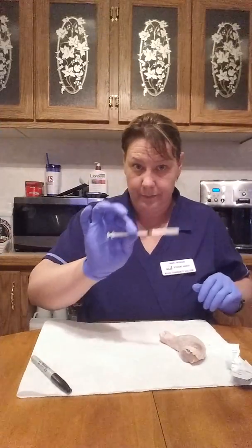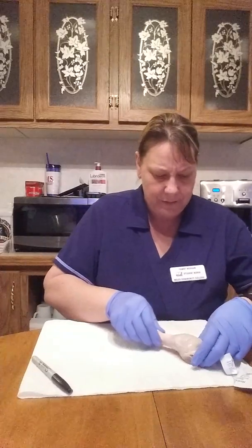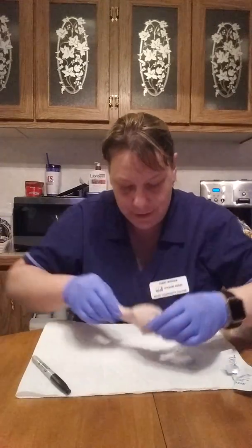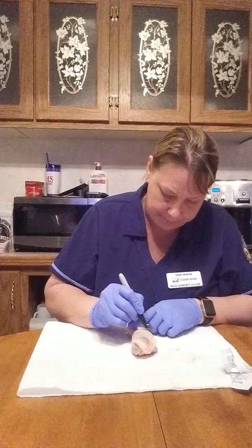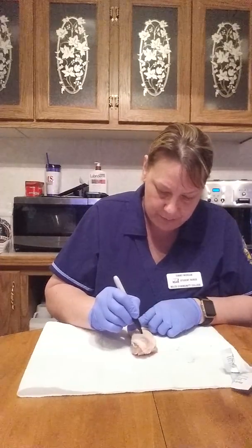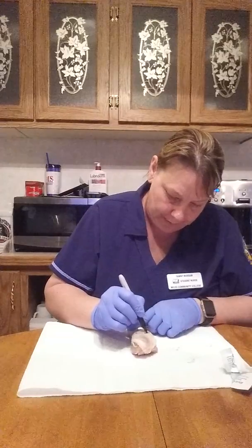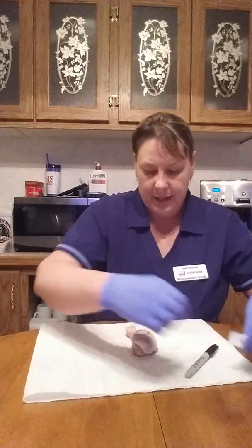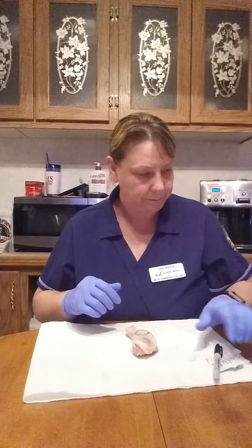Put my needle in the sharps and see if I can show you. I don't know if you can see the wheal on my chicken there. My chicken patient. So I'm going to draw a circle about 1 inch around where I administered my medication and explain to the patient that it's important to come back in 48 hours and have that checked for any reaction to the medication.